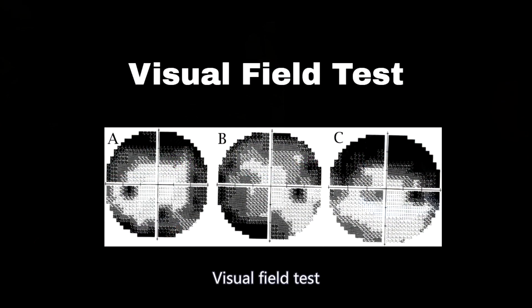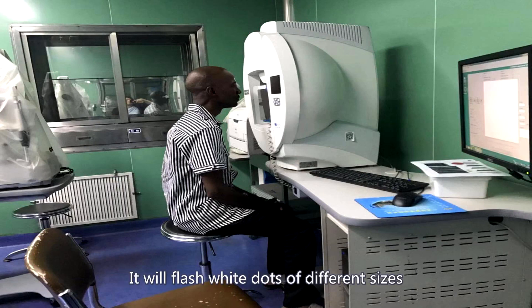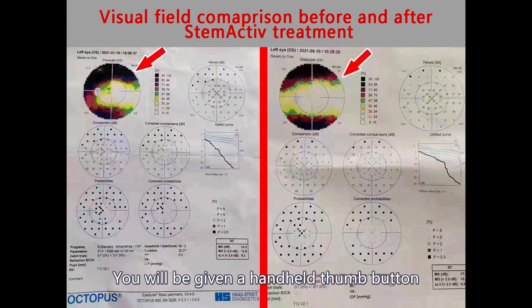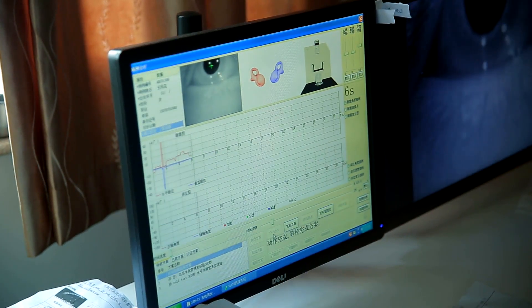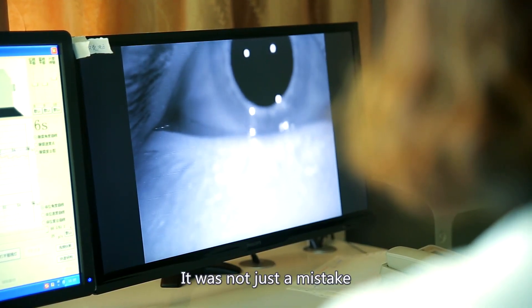Visual Field Test: you place your head in a large white shell. It will flash white dots of different sizes and brightness intensities randomly at different points inside this shell. You will be given a handheld thumb button to press each time you see the light flash. This test shows where you do and do not have vision in your visual field. If you miss a dot, the machine will go back and retest to make sure it was not just a mistake.